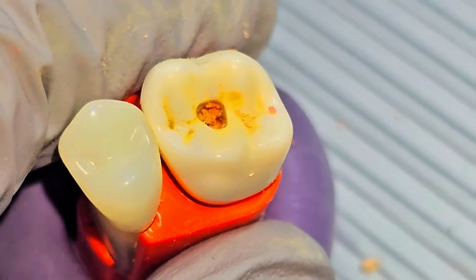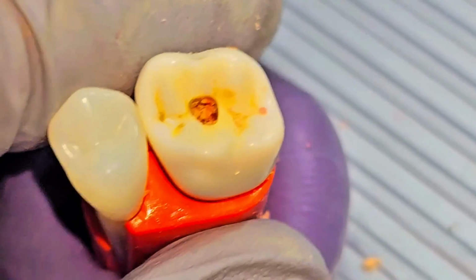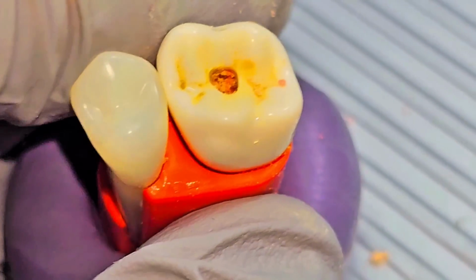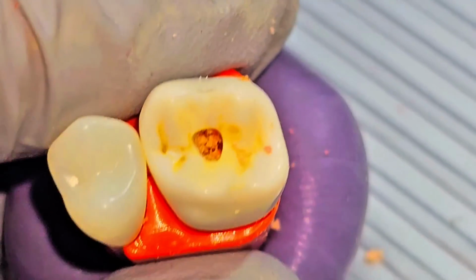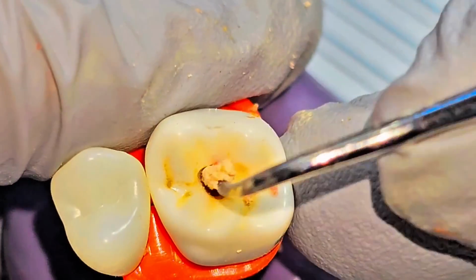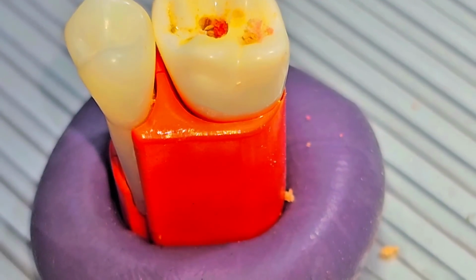At this point, you can irrigate using the syringe with water. But now I'm just going to use a spoon excavator to get rid of some wax.